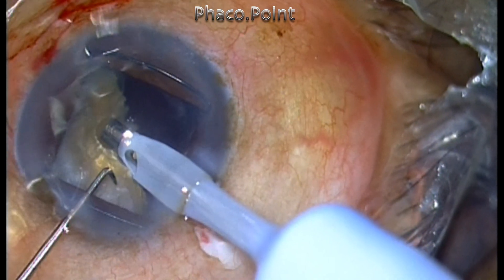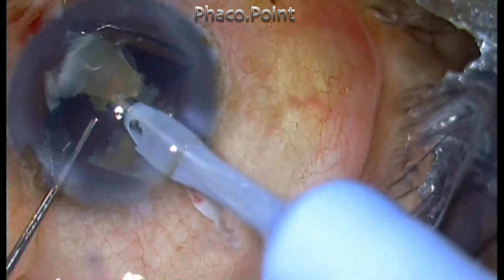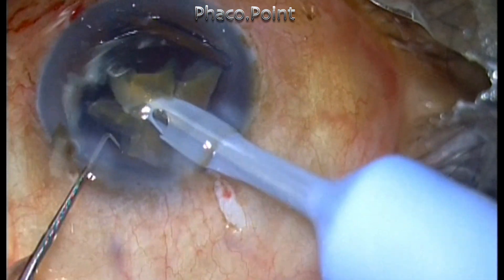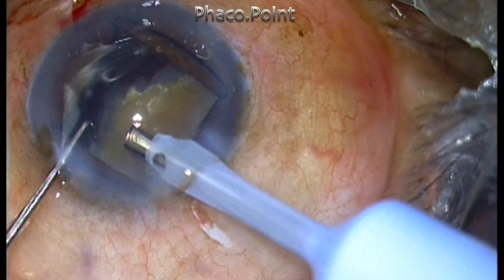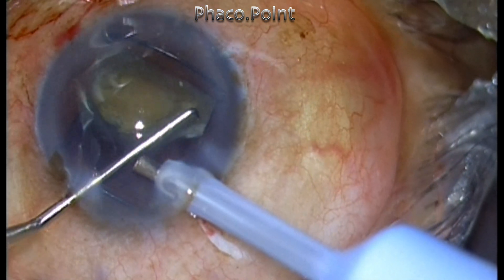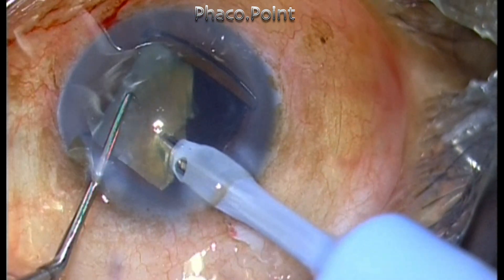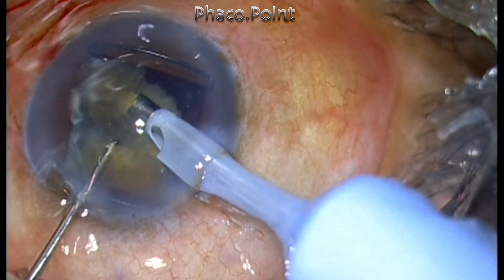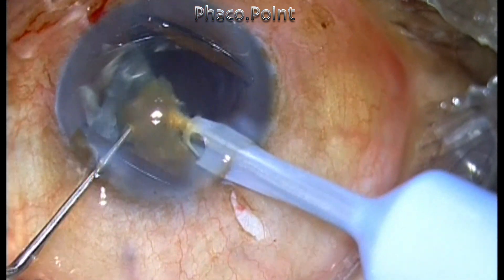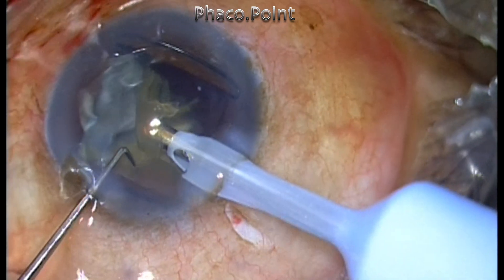As I rotate the nucleus within the capsular bag, I find it is not so large — it is probably going into a hypermature state. However, the 5.5 to 6 mm nucleus is extremely hard and leathery, posing quite a challenge to disassemble. Position the nucleus in a favorable spot exactly opposite the incision before performing the chop, ensure the tip is adequately buried with a good hold, create the crack and lateral separation, confirm the piece is free, then emulsify it in the central zone where the dome of the cornea is furthest from the lens particle.